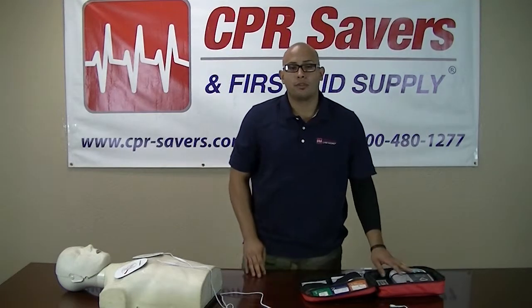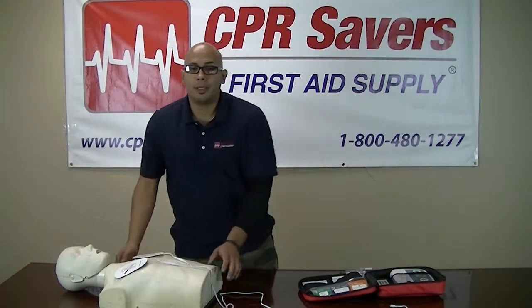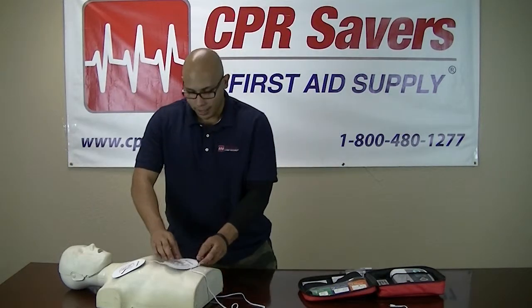The adhesive pads that come with the trainer allow compatibility with almost any type of training mannequin. The pads themselves can easily be replaced by simply disconnecting them from the cord and attaching the new ones.